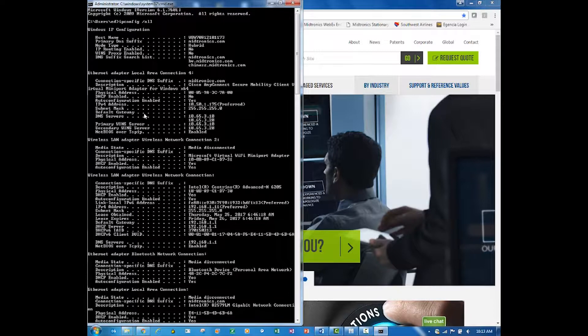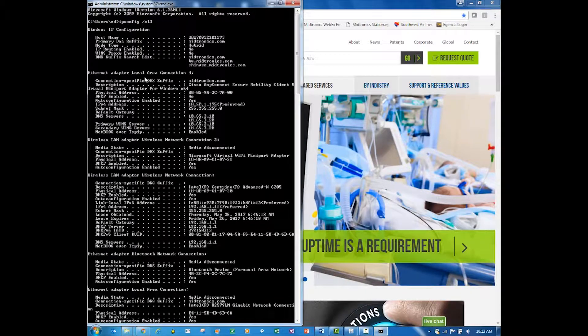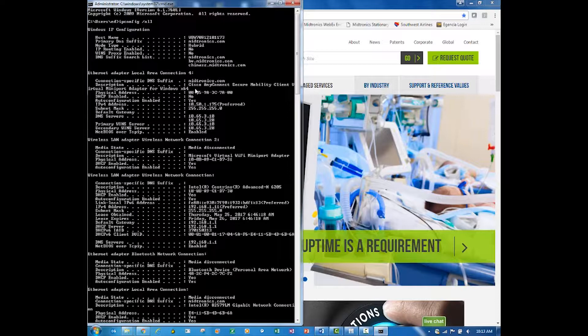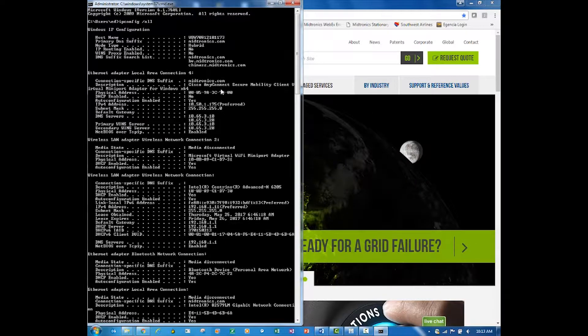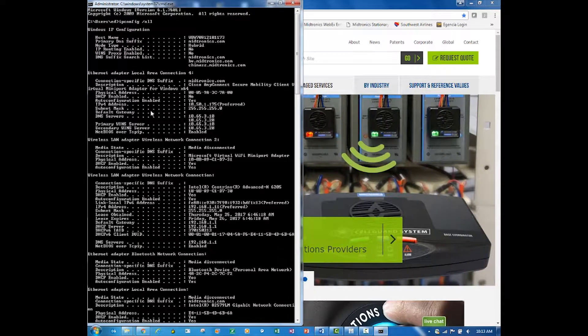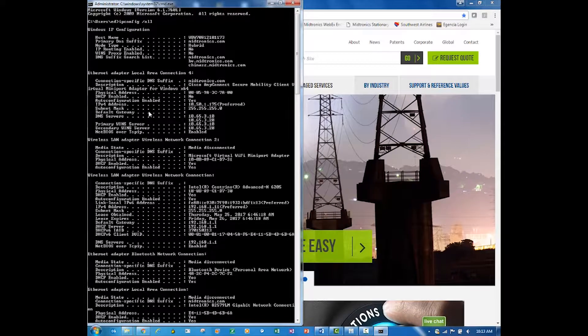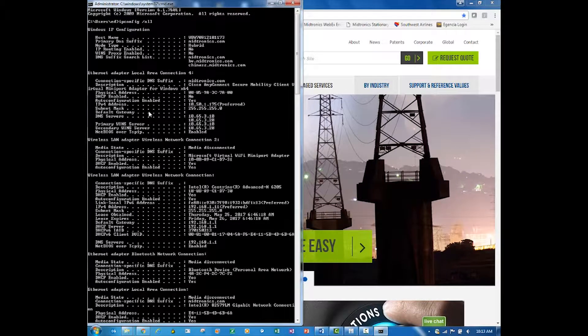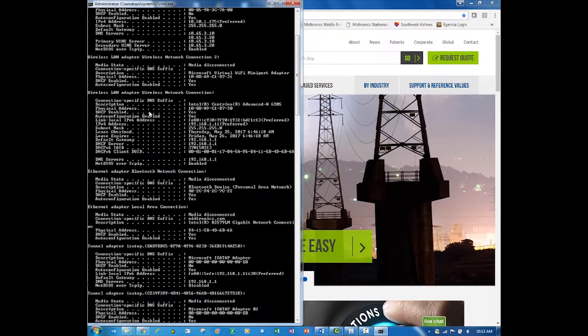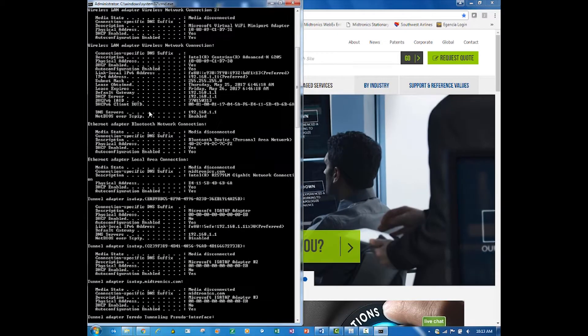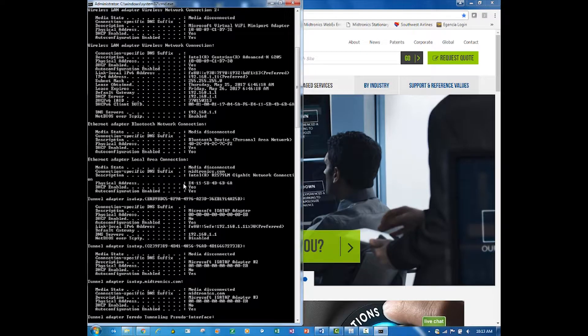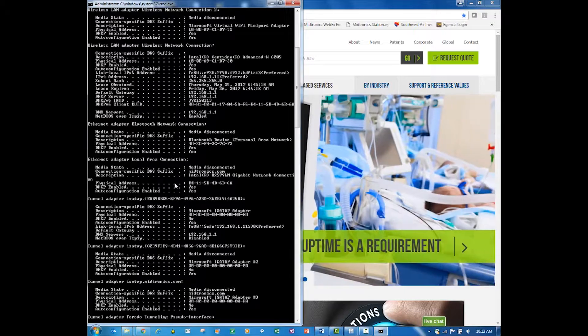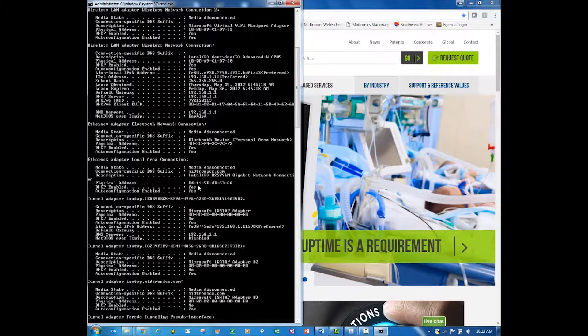Now I have a whole list of all my connections, and I want my local area connection. I don't want this first local area connection because this is my Cisco AnyConnect VPN. What I really want is the true local area connection on my machine.